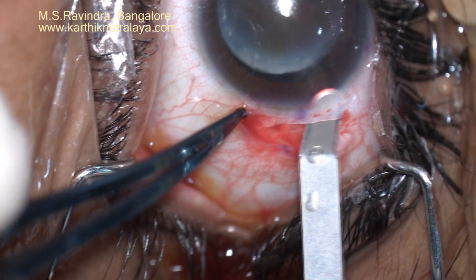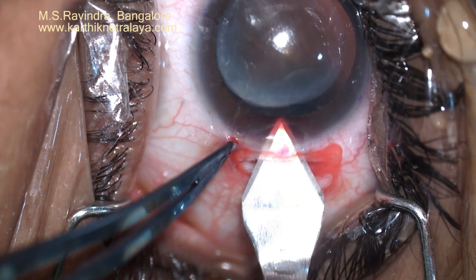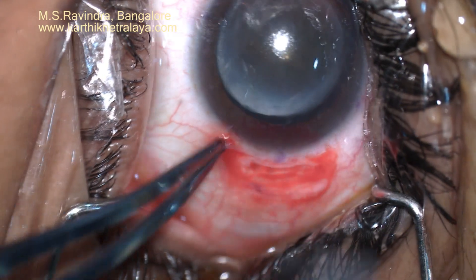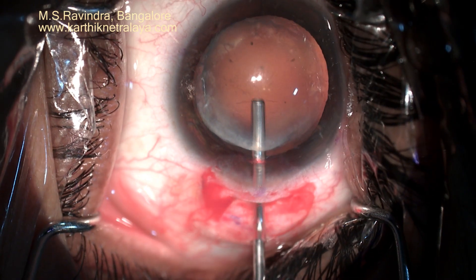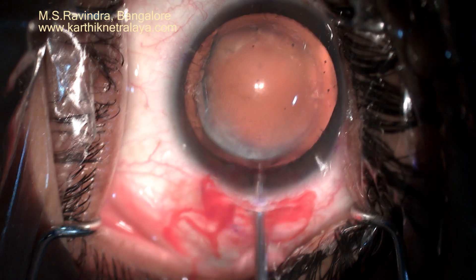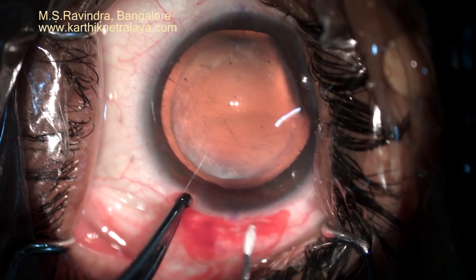Care is taken that the already compromised endothelial count is not further affected. A tiny entry is made into the anterior chamber. Viscoelastic is filled to protect the endothelium — HPMC is the one which protects the endothelium maximally.